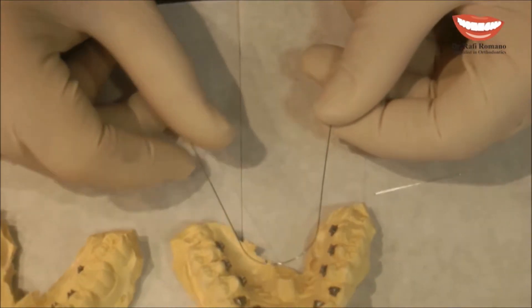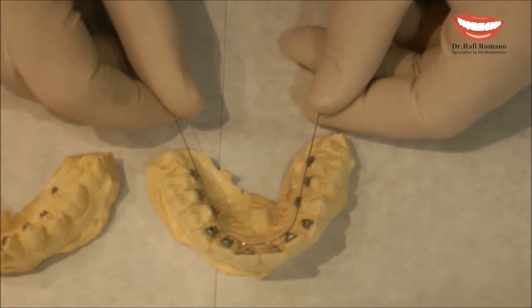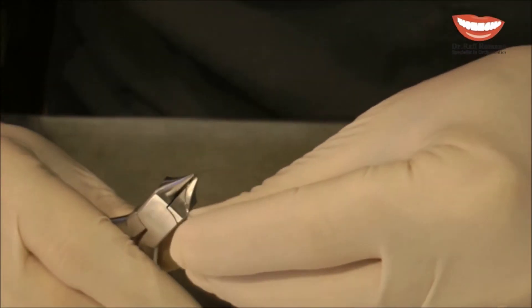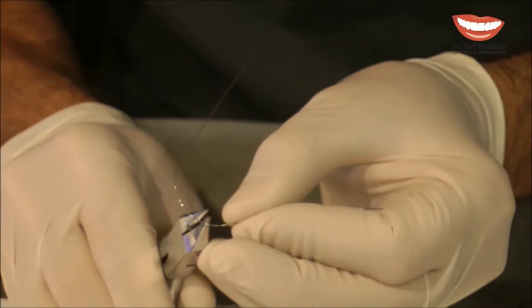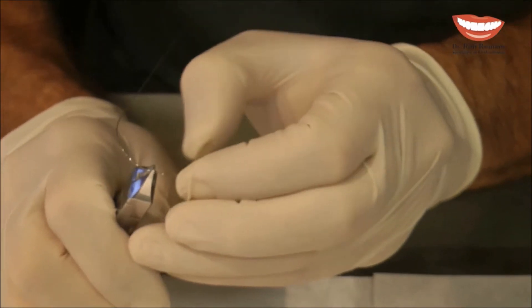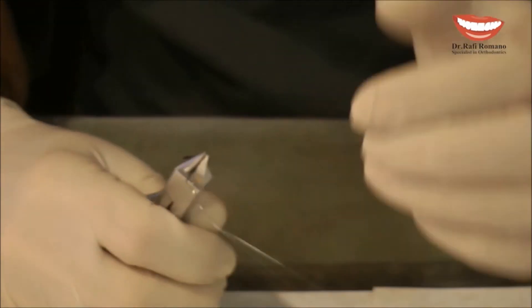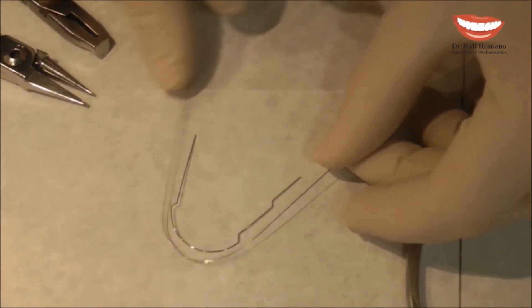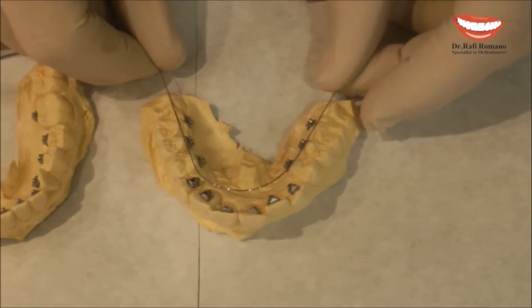The only difference for the upper arch is that we have to design the wire to fit an upper arch versus a lower arch. I take the wire and open it to be more wide to fit an upper arch. Now you can compare the two wires and see the difference in width, and we can repeat the same procedure with the upper arch.